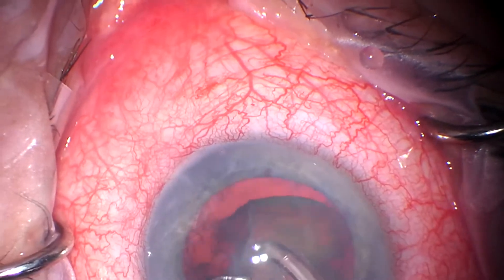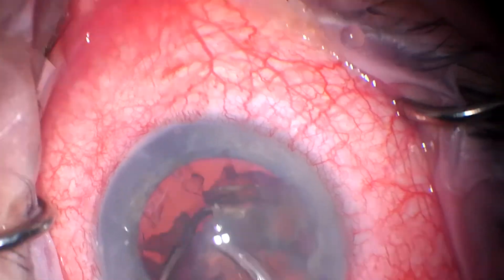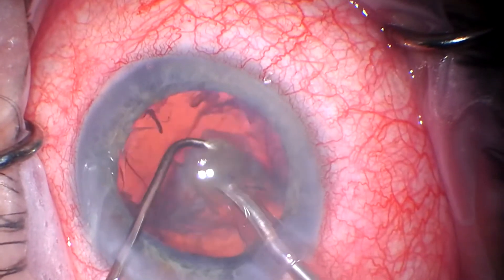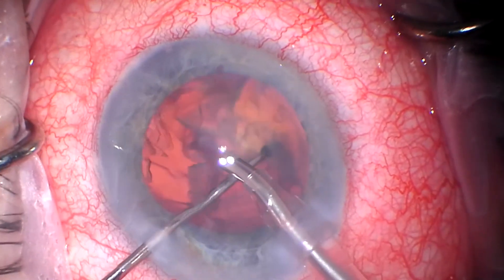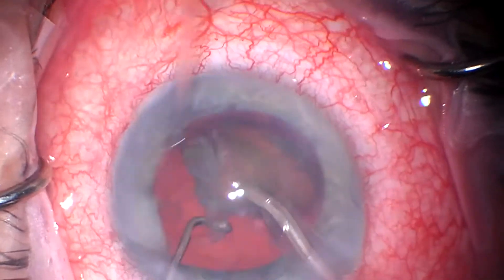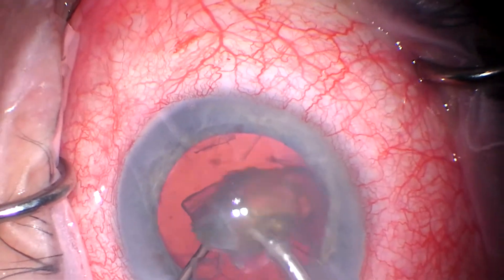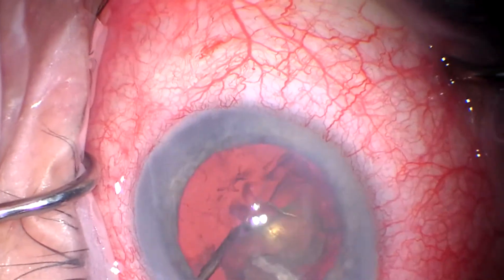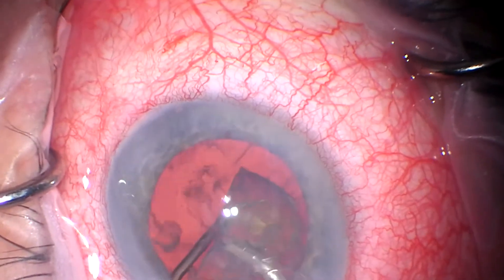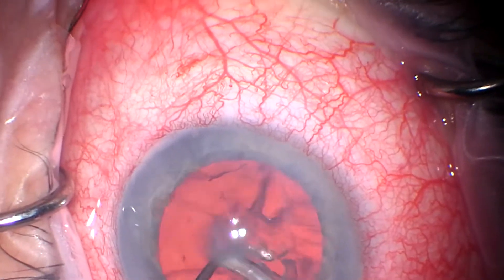So we'll get all these quadrants out. In a little while we'll try to show the episcleral venous fluid wave. You'll look for that sort of towards the top of your screen — those vessels that are above the iris. You'll see them blanch with increasing the pressure of the BSS infusion.